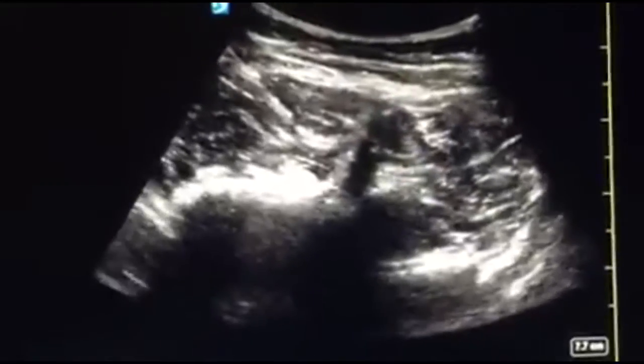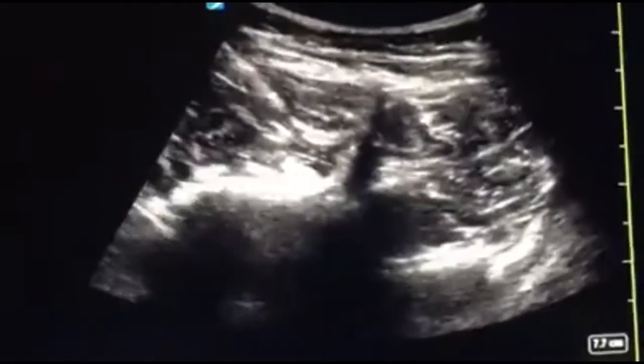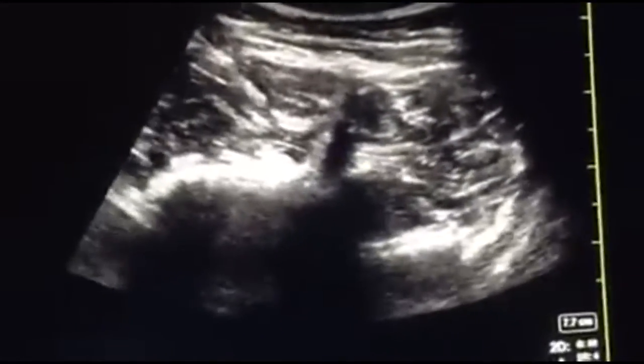We are going to discuss something about quadratus lumborum block. This is the recorded video. So this is the transverse process. This is the body of the vertebra. So above the body, inside, this side is the abdomen.